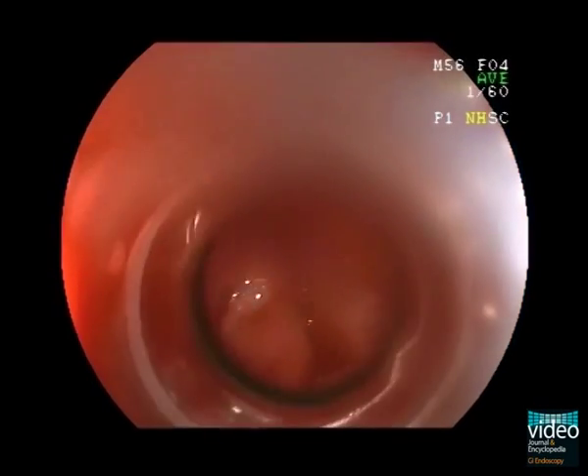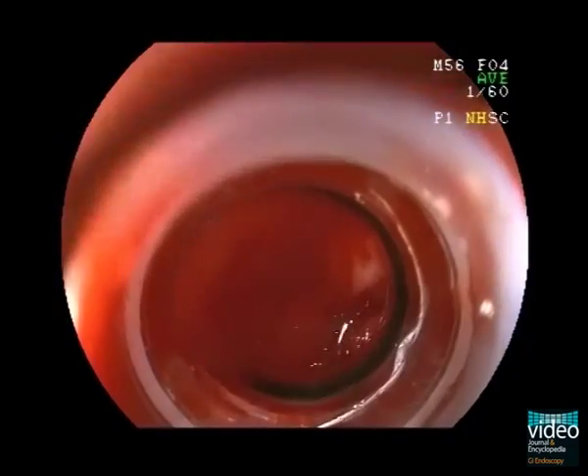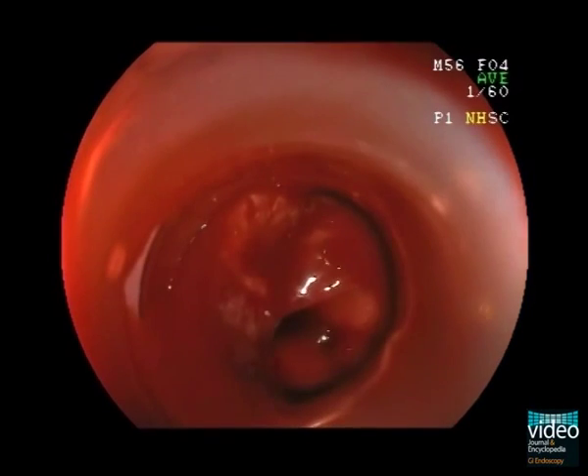Keeping the endoscopic view clear when there is active bleeding can be problematic. In this situation, the endoscopist can rotate the endoscope using the transparent cap to compress the varices and decrease the blood flow.